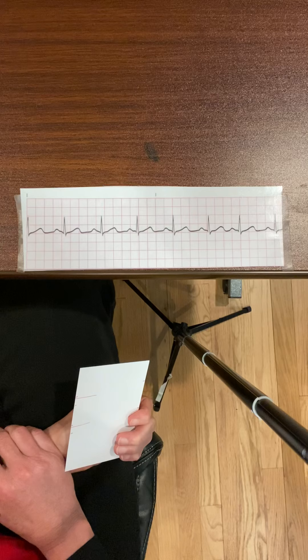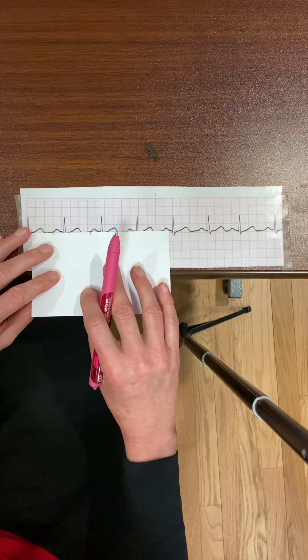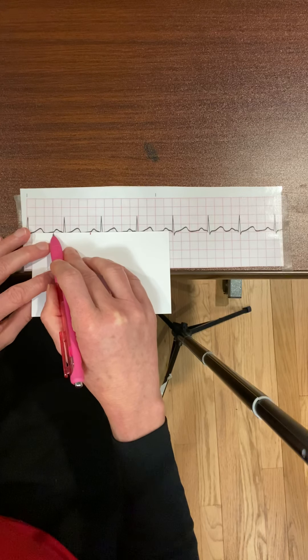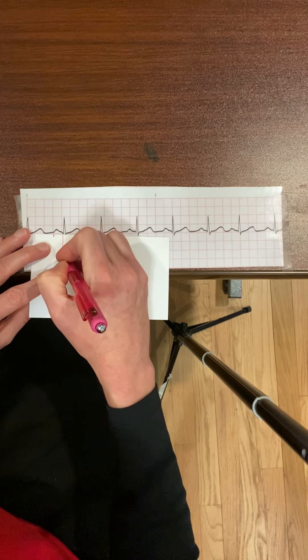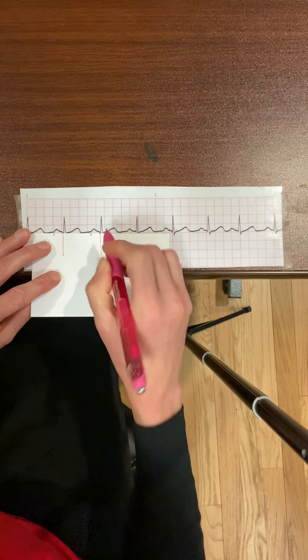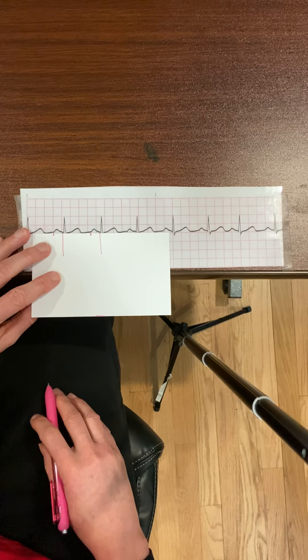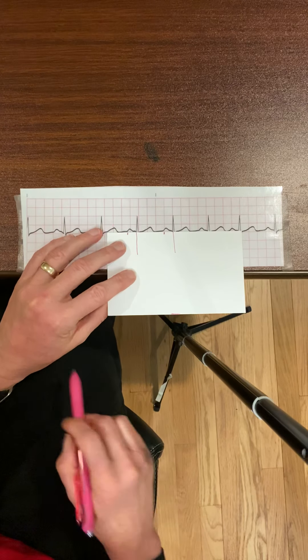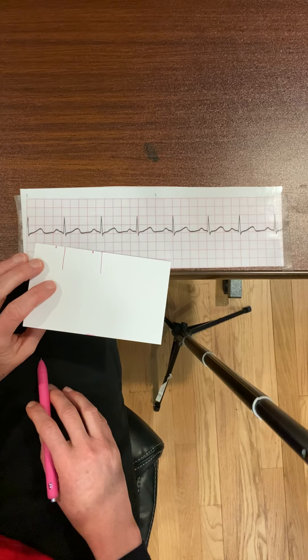Next, I need to measure the PR interval. I already have a little line at the beginning of my P waves. I'm going to draw a line at the beginning of the QRS — you measure the PR interval from the beginning of the P wave to the beginning of the QRS. I match it out to check if the PR interval is consistent throughout, and it is — my PR interval is consistent.